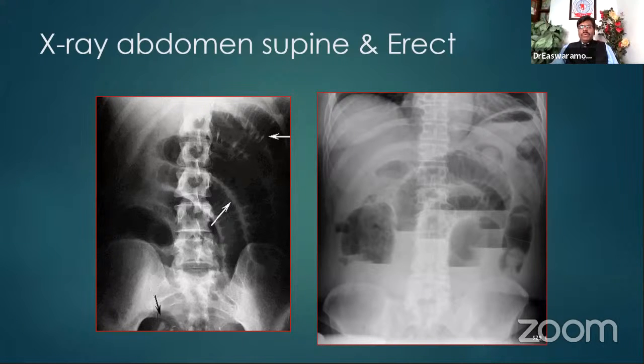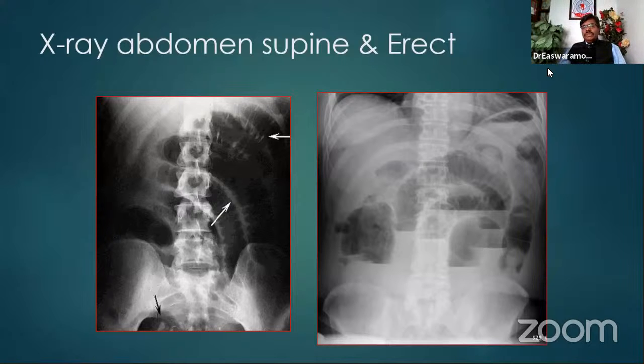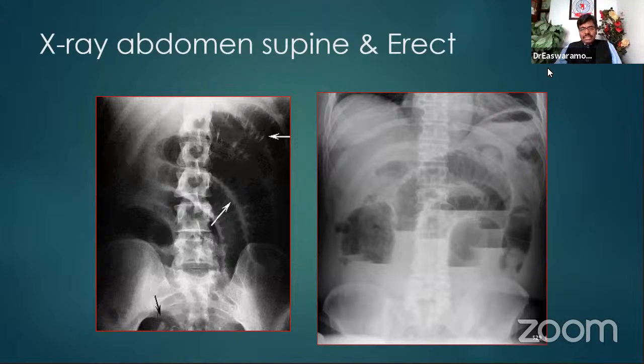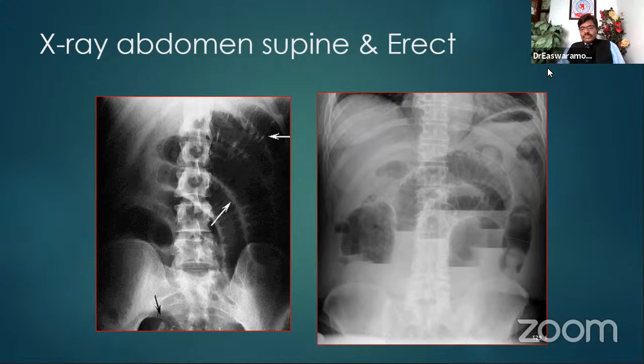With that background history, with this X-ray staring at you, Ragadarshini, can you try to unmute and give your answer to this, if you want? Sir, I don't know, sir. No problem. Mohita, would you like to try? There is no problem at all. Yes, Mohita, we are waiting to hear from you. Whatever you say is welcome. Yes, I can't hear you. You are unmuted.